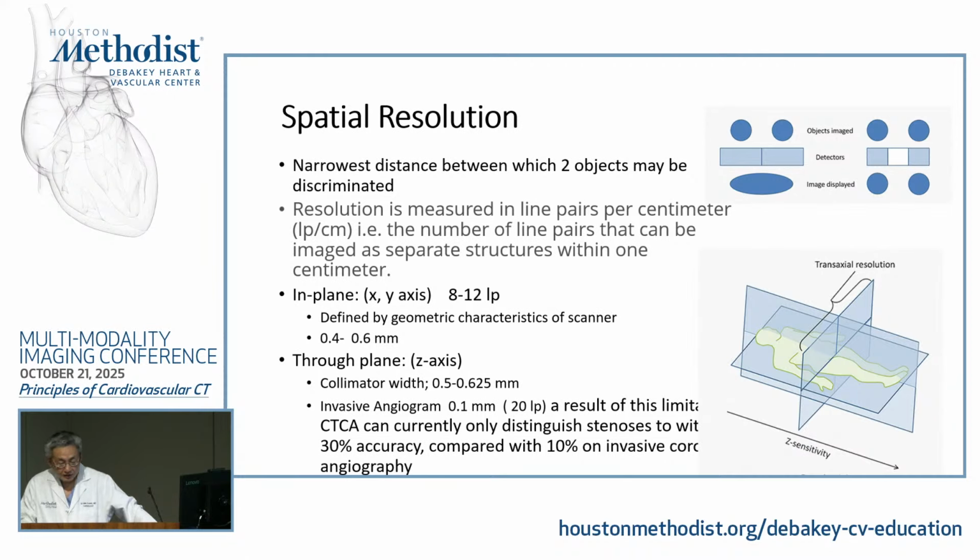So how good is the spatial resolution of CT? This essentially tells you what spatial resolution is. Imagine these are two vessels side by side. If your detector, which determines spatial resolution, is very big, you won't be able to tell that these two are actually different.